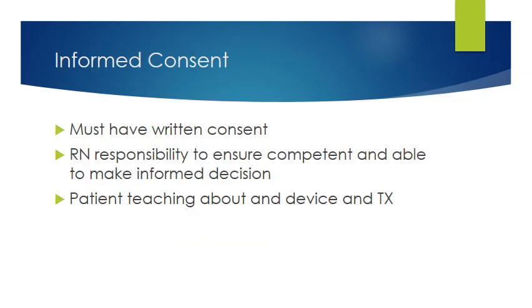Informed consent. This is an invasive procedure, so central lines must have informed consent. Patient has to know what they're getting themselves into. So it's your responsibility as the nurse to make sure that they're competent and to ensure competency, and that they're able to make an informed decision to get this line put in. And then, of course, patient teaching would be about the device and any treatment that you're going to give them through the device.